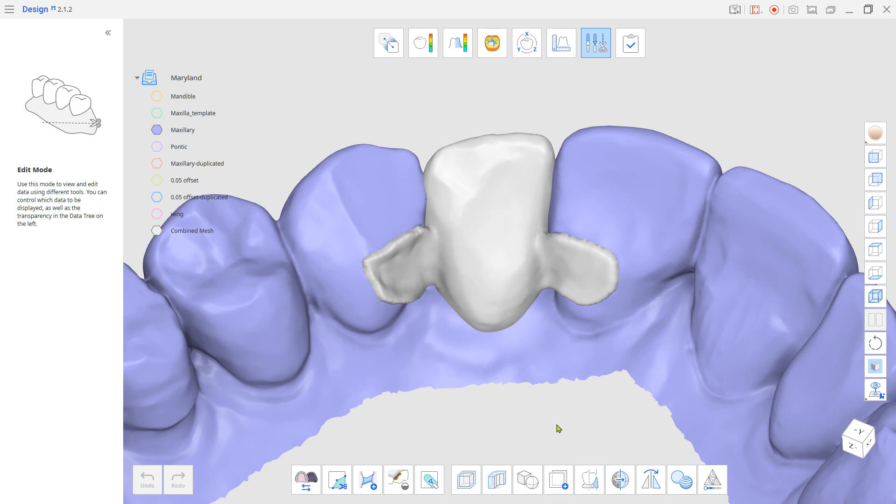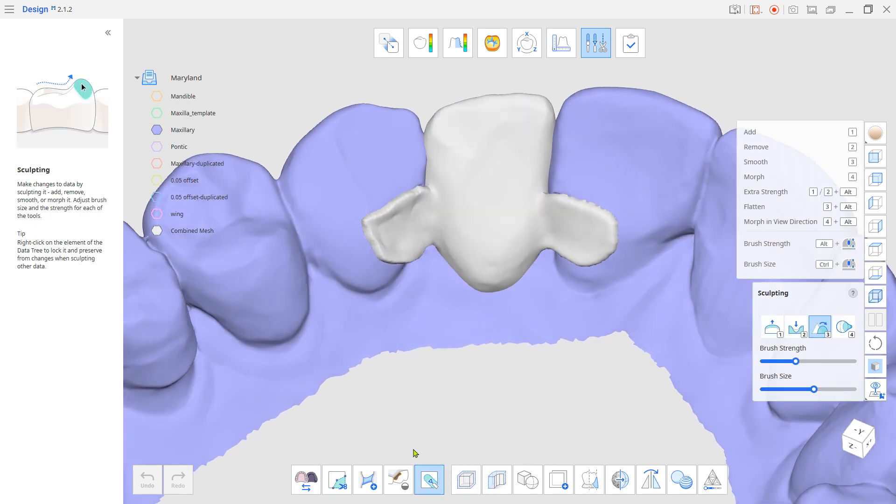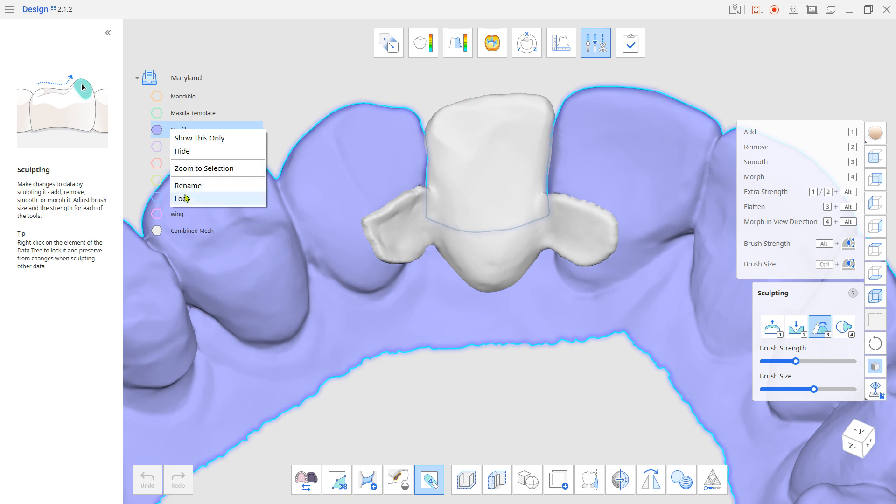Now use the Sculpting tool to finalize the Contour and Occlusion. Don't forget to lock the Scan Data.